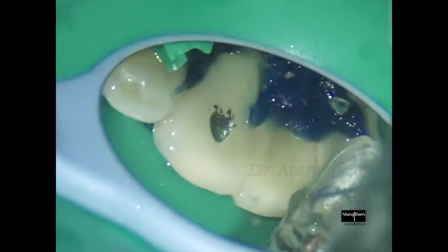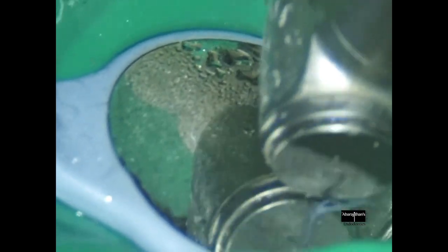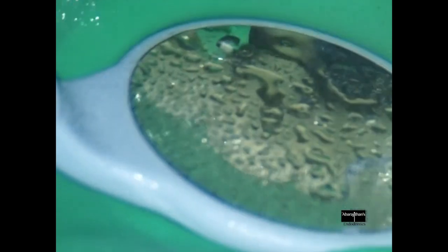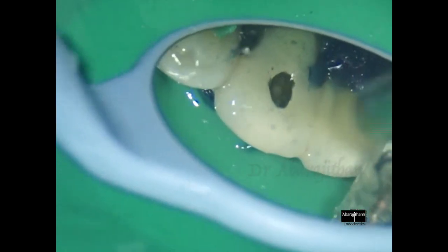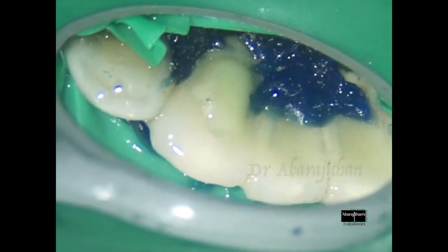You can see I am clearing the ceramic part pretty wide so that I can avoid iatrogenic errors. Once I have done a sufficient window with my diamond burr and exposed the metal part, now I use my Trihawk burr. It is very quick to cut through the metal — in less than a second or two I have gone through the metal and now I am just widening the window further. In this case, to my surprise, even before I completed my access or even instrumented the canal, I was able to see a lot of pus coming out of the access cavity.